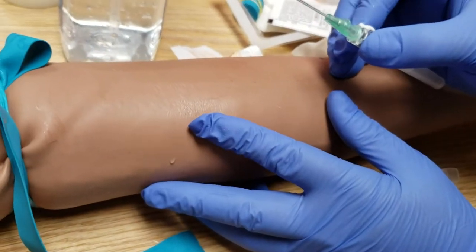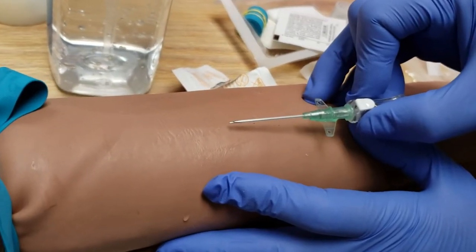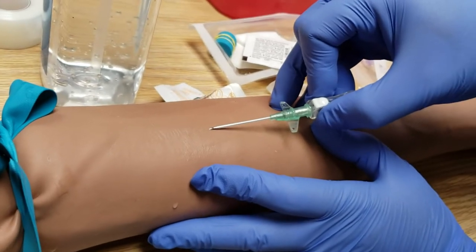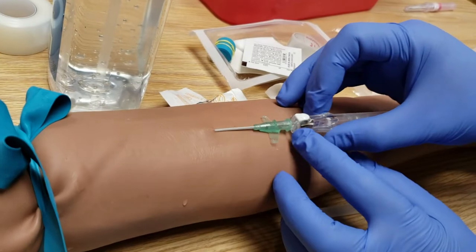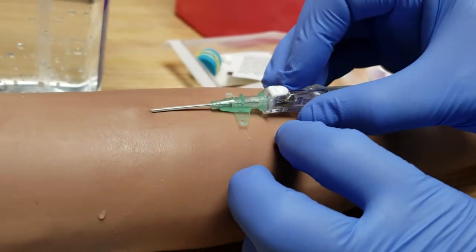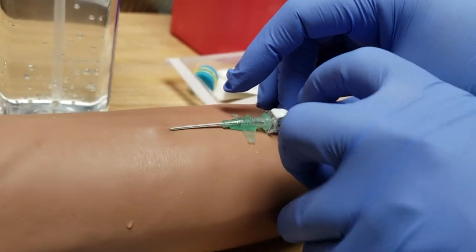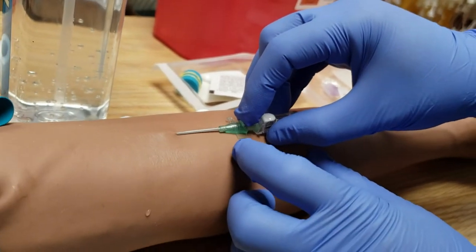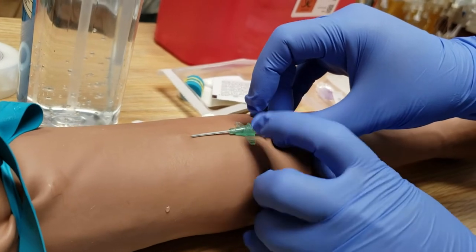I know where I'm going to go. Angle it just a bit, about 20-25 degrees. Find the vein — when you find it, stab in. You'll see a flash. When you see a flash, keep your fingers stable on this one because this has the needle and you don't want to move the needle anymore. If you advance it further you could go right through the vein, especially for patients who have very small veins.